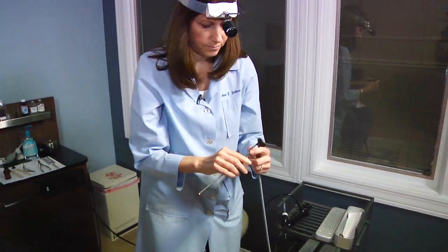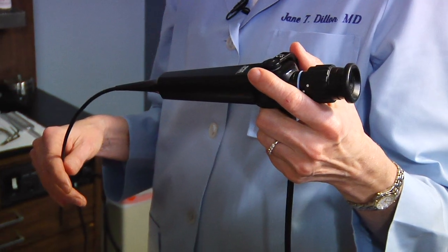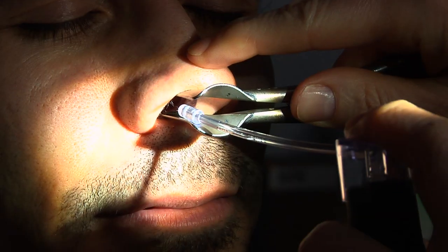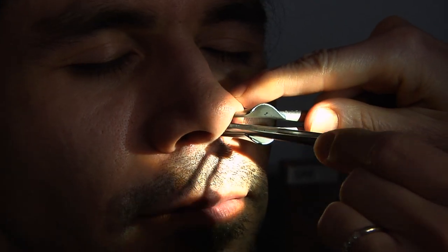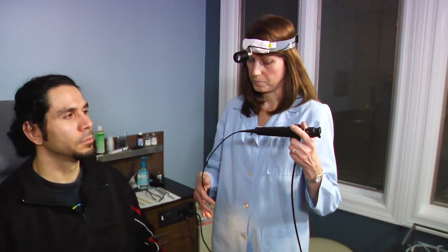Nasal endoscopy is often performed by the otolaryngologist using either a rigid or flexible scope and includes evaluation of both sides of the nose. Now I'm going to check your nose and your throat with a special scope. Before I do that, I'm going to anesthetize your nose. We're going to do one technique on the right side, which is spraying the nose, and on the other side we'll pack it with a little piece of cotton that has the anesthetic on it. Allow adequate time for the anesthetic to work before proceeding. With a calm and patient approach from the provider, most patients will tolerate the scope exam very well.